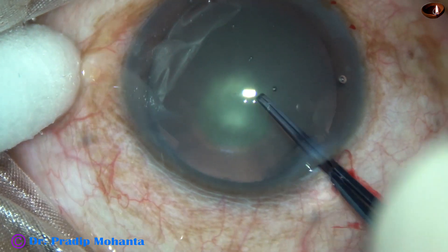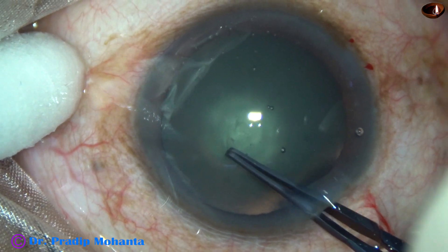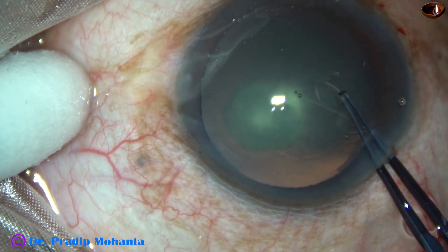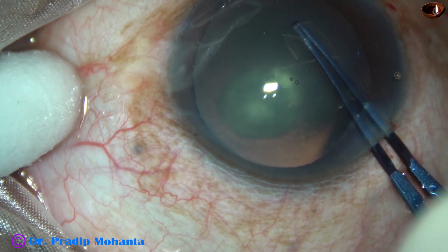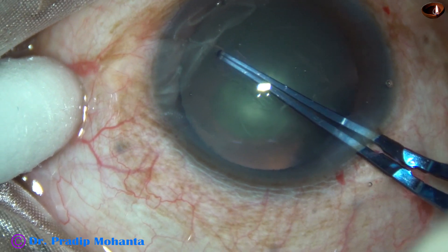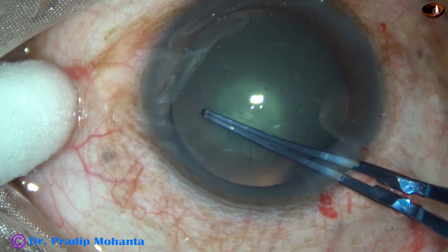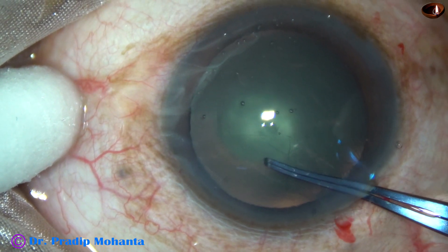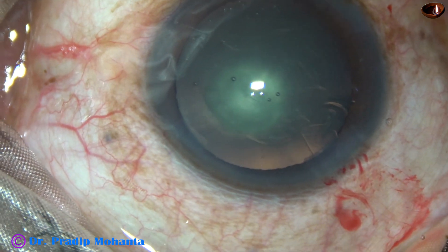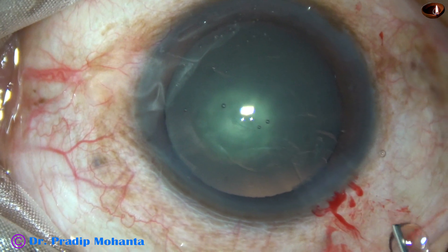A Utrata forceps is taken, a capsular tag is raised with its tip, the tag is held and guided anti-clockwise such that the torn margin is at a certain distance from the margin of the dilated pupil. Since I may have to place a lens in the sulcus in this case, the size of this rhexis is about 5 mm or 5.25 mm.